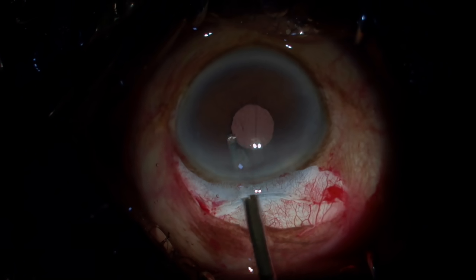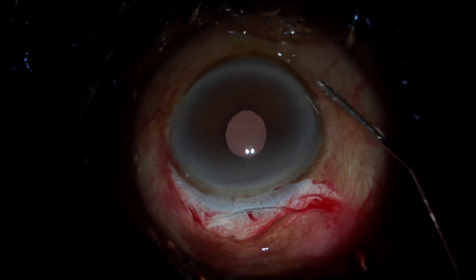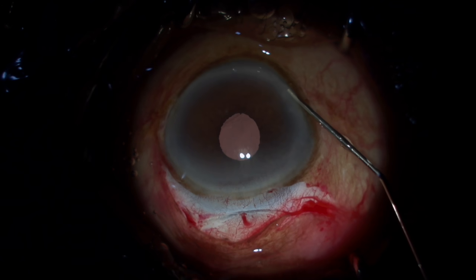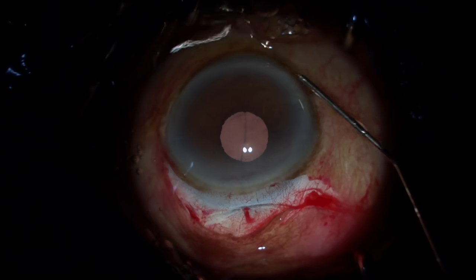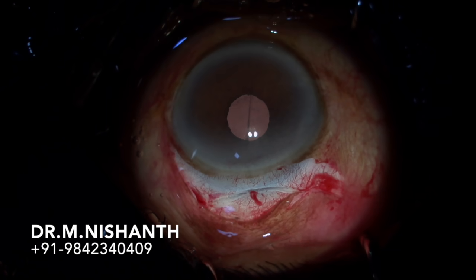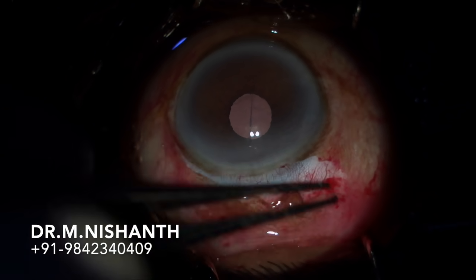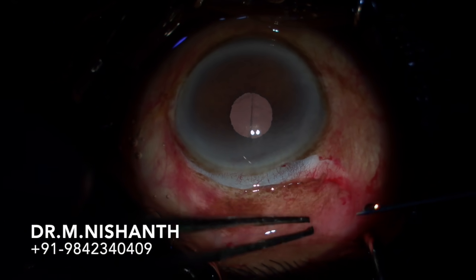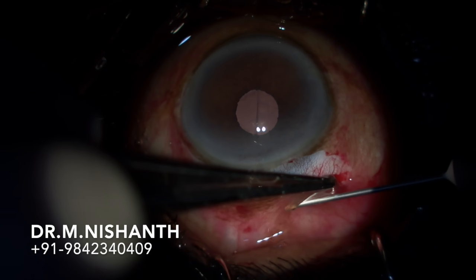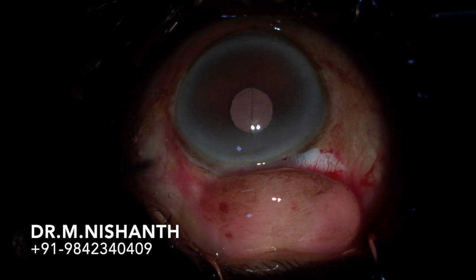Do not inject with force as there are chances of endothelial cell loss. For stromal hydration and forming the side port, keep injecting, go towards the side port, inject, and come out with continuous irrigation — you can see that the anterior chamber is formed. I do not cauterize; instead I use subconjunctival dexamethasone with antibiotic and inject between the conjunctiva and the tenons for ballooning, which will close the section.